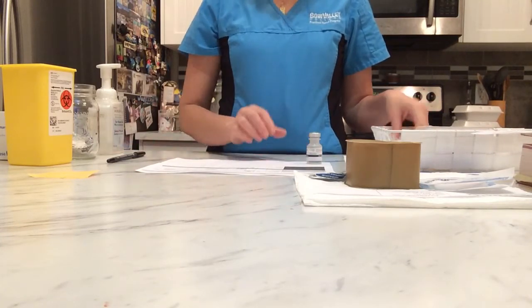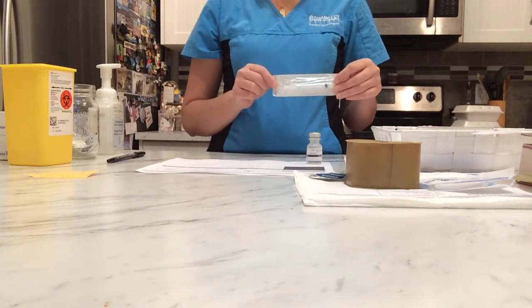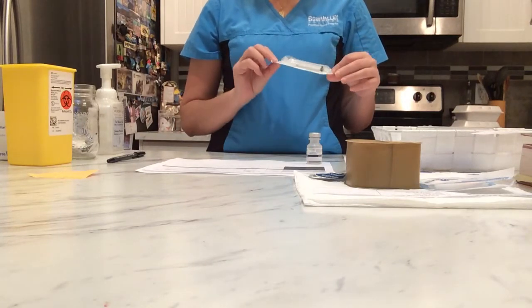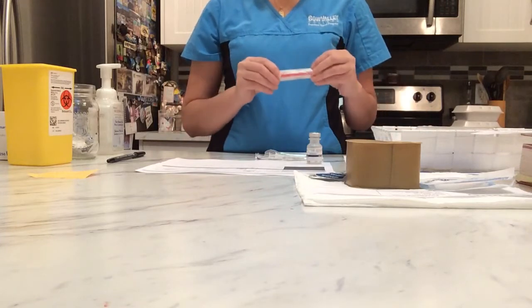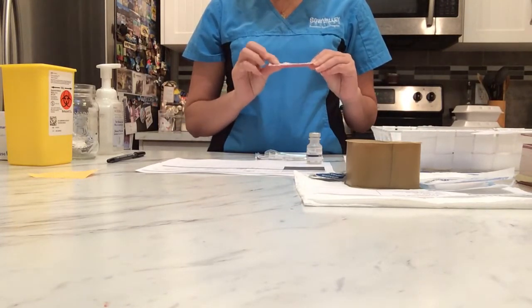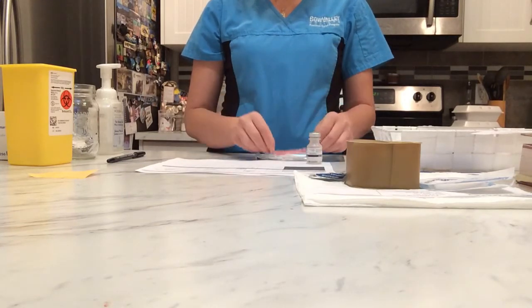Since we have to withdraw 1 mL, I'm gonna choose a 3 mL syringe, expiration April 2024, hasn't been opened yet, it's intact. I'm also gonna use a Blunt Fill needle without filter since it's a vial, I don't need a filter. And this expires April 2025, it is intact.